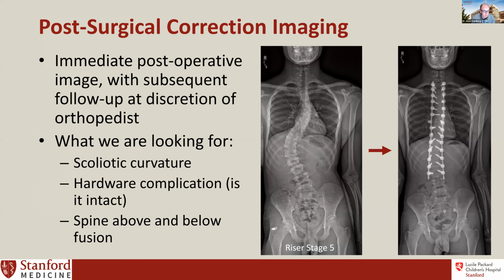So oftentimes, if there is a leg length discrepancy, we've instructed not only our techs, but our pediatric orthopedic surgeons are acutely aware of it, and they'll put in the order form, please put a block under the patient. Oftentimes our radiology suites are where the pediatric orthopedists are, so they're able to communicate directly with each other.